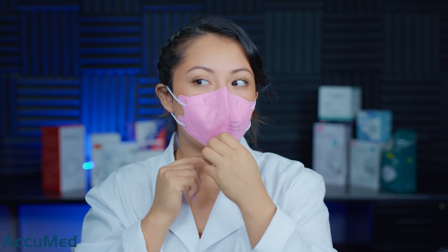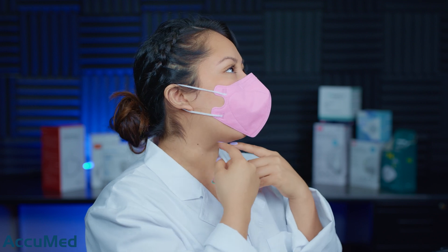Let's go ahead and try it on. If you saw the previous review for the Adults K95 from Ambrose, they didn't fit my face properly — they were a bit large. I was hoping that maybe the kids size would fit me, but they seem a little small. There is a big gap here so it doesn't actually go around my whole chin.